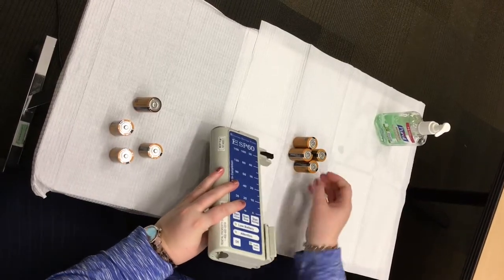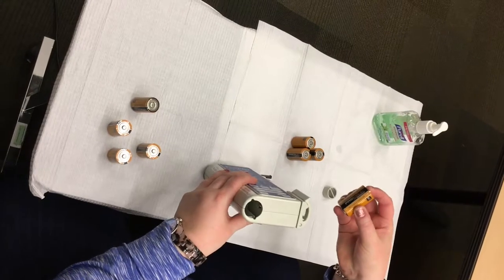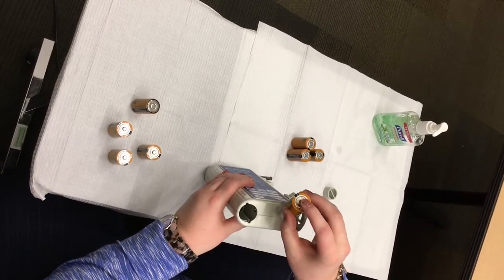Insert four new C-cell batteries into the pump with the negative flat end of the battery going in towards the top of the device and the positive pointed end facing out.